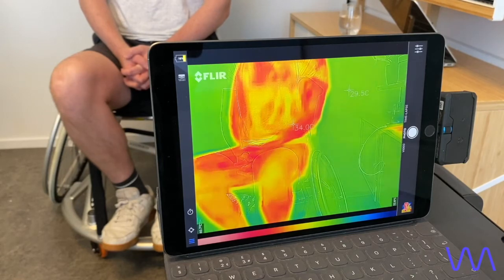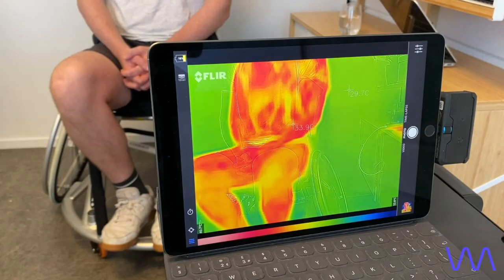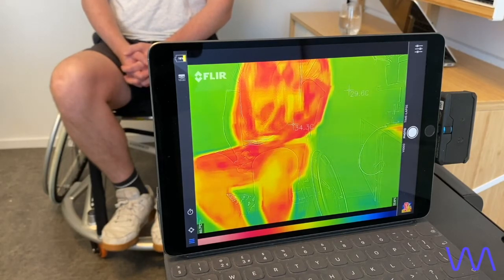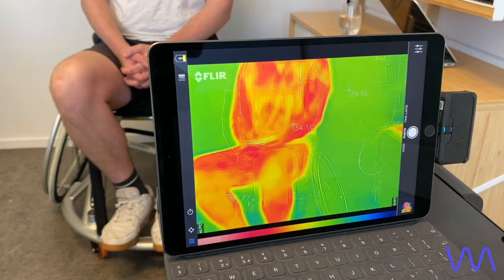We've shown, and other researchers have shown, that the backrest itself can rise up to 10 degrees in half an hour, while the skin temperature can rise about 2.2 degrees in half an hour. Now, 2.2 degrees might not sound like a lot, but in terms of body temperature it is, because the skin temperature will have an influence on your core body temperature, and even the slightest difference of half a degree or 1 degree can hugely affect how a person operates and functions. So we'll see you back in half an hour to see the difference in temperature.